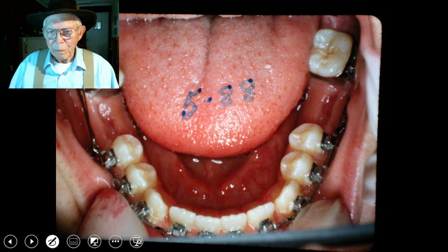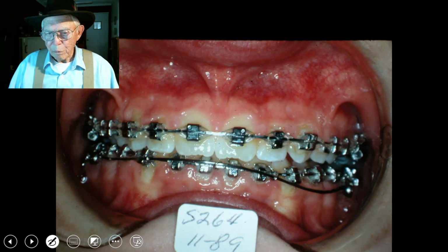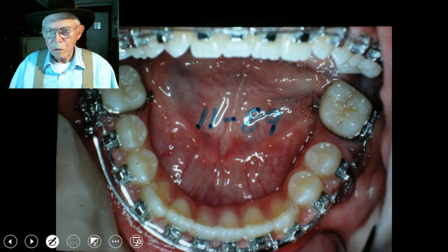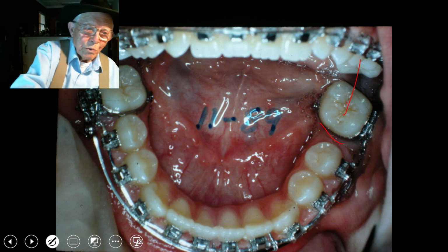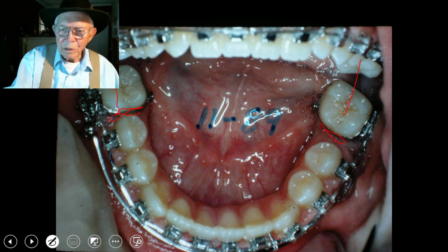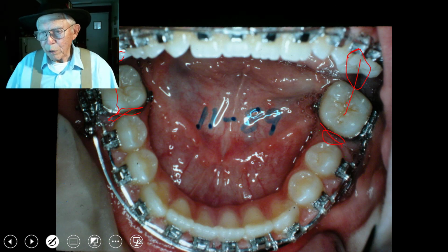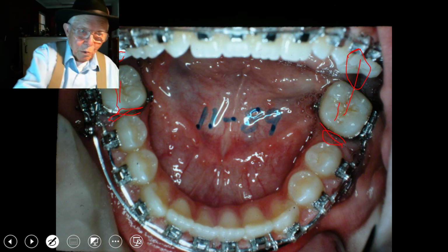We'll close this up, and I'll show you where it goes back up underneath there. All right, we put this intruding arch on there to bring that down, to give it overjet and overbite, so it functions properly in there. And that's the intruding wire doing that for us. And this space right here, this is the second molar, came from way back here. This one's already up there, and this one just lacks a little bit. It'll be there, and then we're going to hold that open back here for the wisdom tooth. And this is the second molar right here. And that's second molar, of course, too.